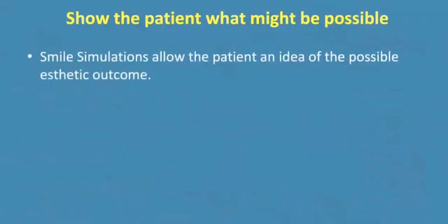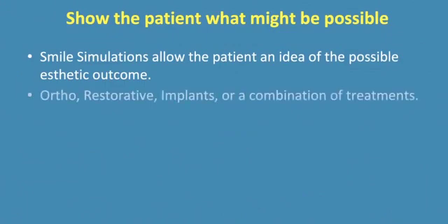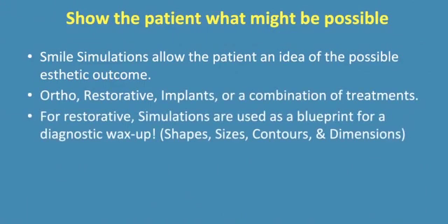So you want to show the patient what might be possible. The smile simulations allow the patient to get an idea of what a possible aesthetic outcome might be. We're not talking about the how. We're talking about the what if in these pictures.